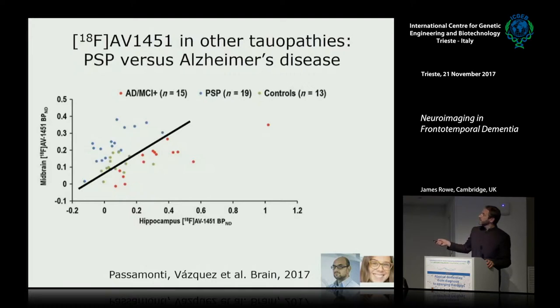And we can see between the patients here, with PSP in blue and AD in red, clear separation. Okay. So the simple bivariate case, two locations, complete separation of groups. And I think many of the studies published to date have missed the importance and the potential of this ligand and others like it by an oversimplified analysis.